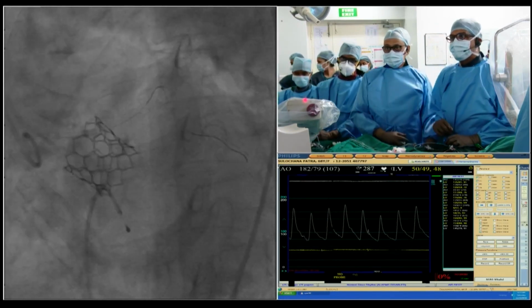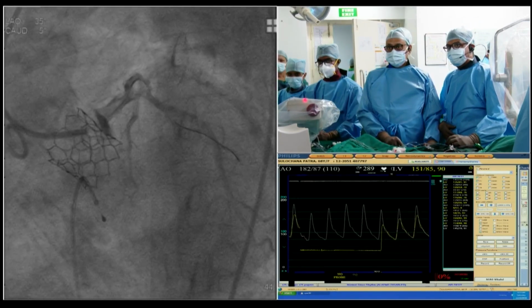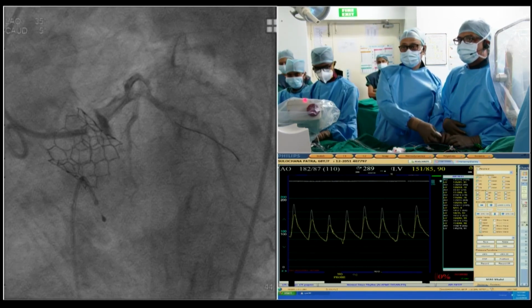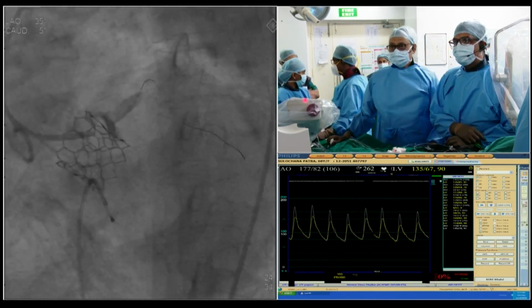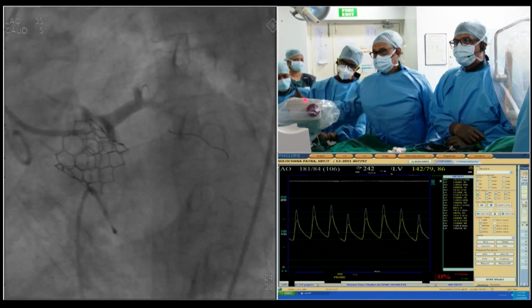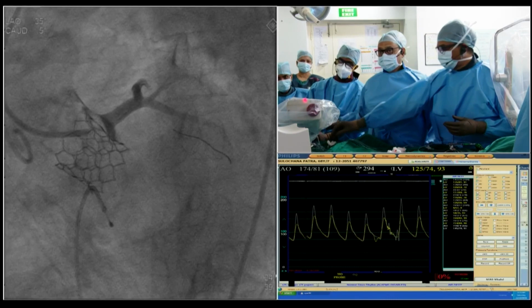If you're taking another stent, yeah, make sure it's either 4.5 or 5. Fluoro, save that and play that, please. Play it. Yeah, sorry, Anil. Freeze. It's definitely moved by like 4 millimeters inside, almost.